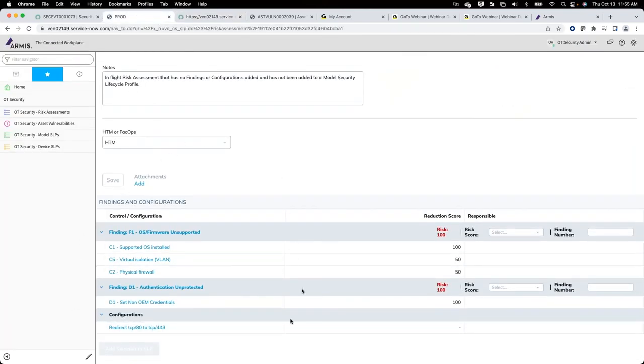So this is the information you're finding in your MDS2 form. Reading through the way this is going to be used within your environment, and understanding any of the risks that it may bring into your environment and having a corresponding control is really the foundation to this.